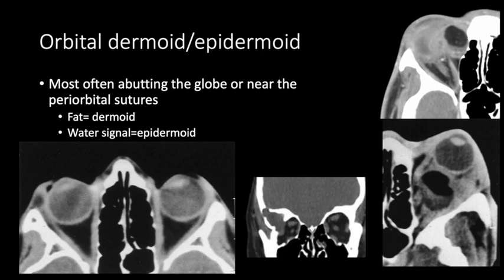Dermoid and epidermoid are congenital lesions that gradually increase in size. If we see fat density, we should think about dermoid — here is a dermoid with fat density in the extraconal space causing mass effect, and here is a retrobulbar dermoid also with fat density. Here we see an epidermoid with fluid signal intensity causing expansion of the bone and extending into the extraconal space, and another small epidermoid on the lateral aspect of the orbit.